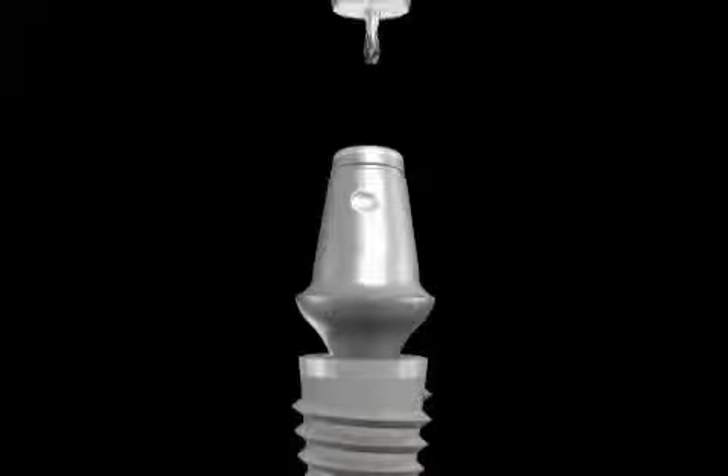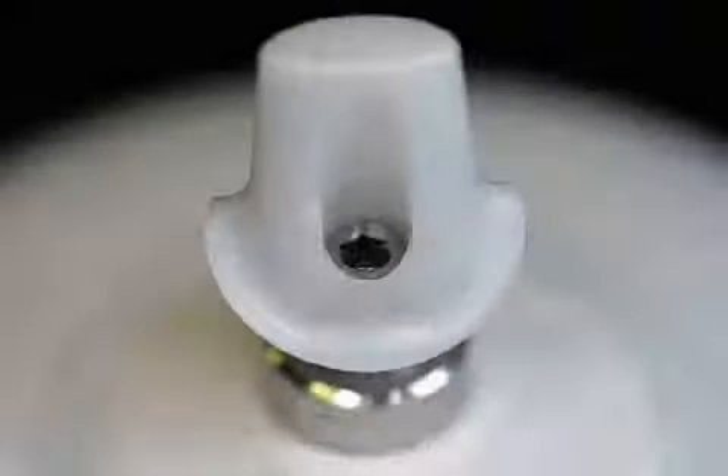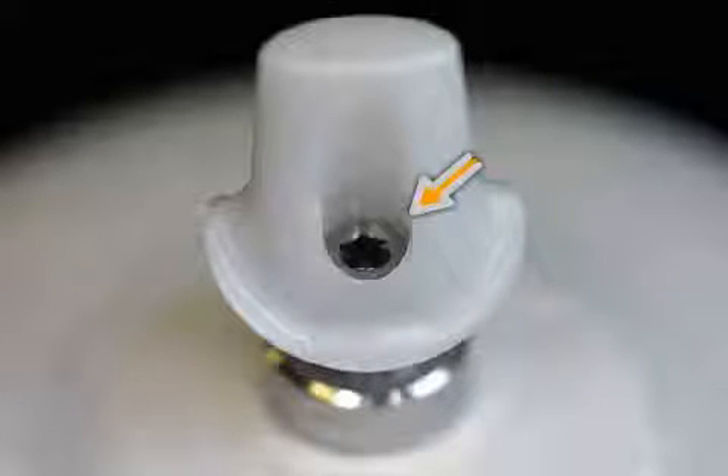Abutments are screwed onto the implant. Here you see a zirconium abutment on a plaster model from above. The fixation screw is clearly visible.